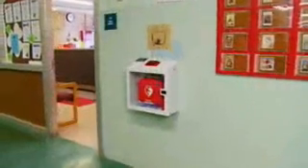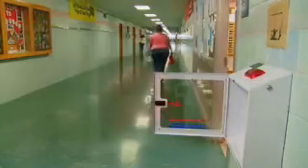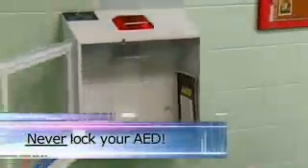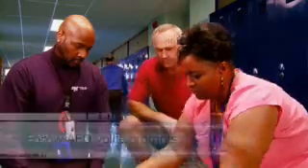Storing an AED in a highly visible, easily accessible, and central location rather than behind a closed door can mean the difference between life and death. Never lock your AED. Easy access is key. Once the AED is retrieved, the pads should be placed on the victim's bare chest. Then follow the AED voice prompts.